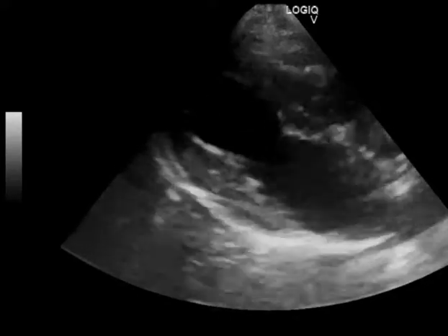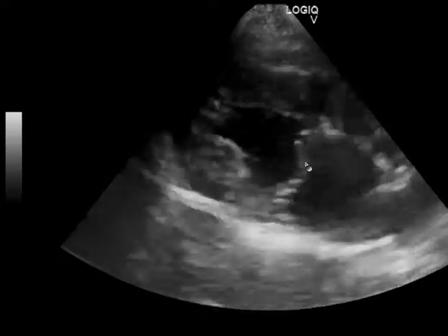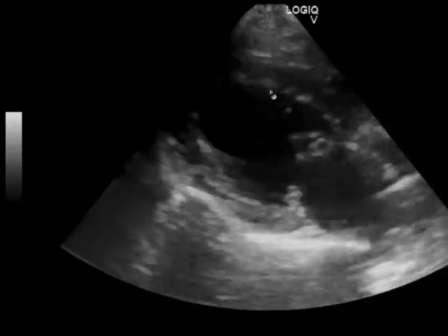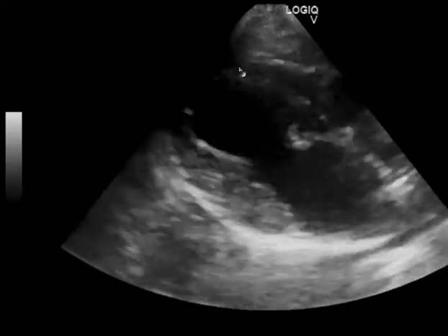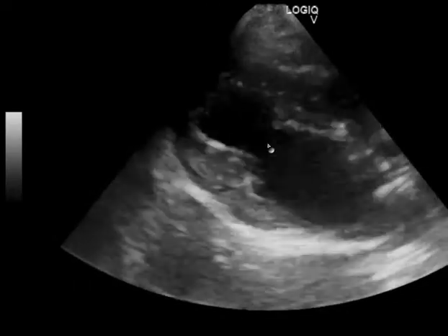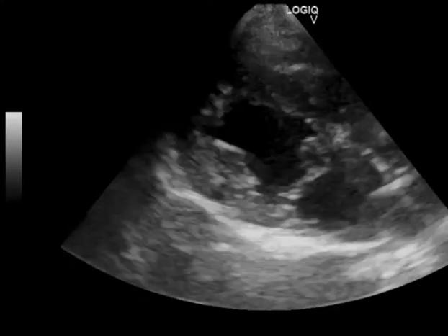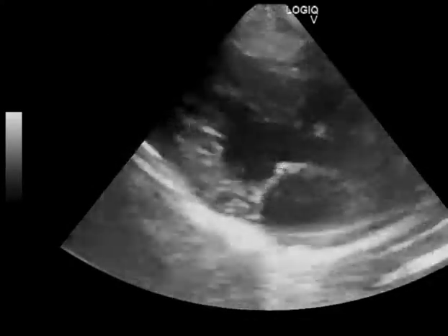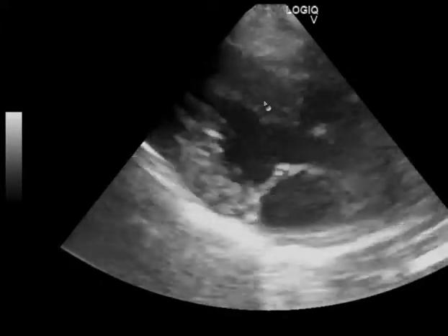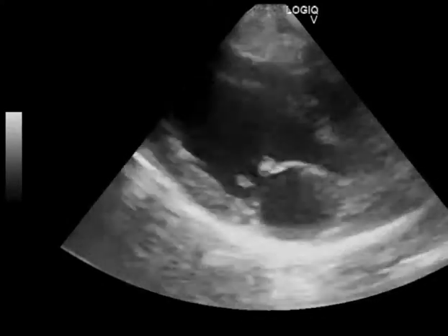These are tilted bricks — the tilted four-chamber right parasternal long axis — and you don't want to measure from these because you're not perpendicular to the septum and the free wall. You're oblique, so all your measurements are going to be off and your systolic motion between septum and free wall won't be in line. The way you correct this tilted brick issue is sliding dorsally towards the spine and potentially going cranially a rib space if needed.